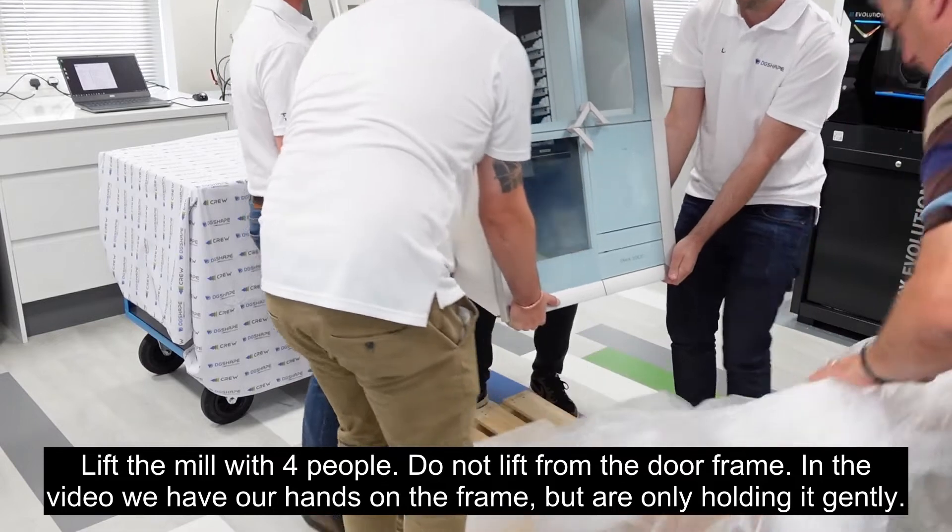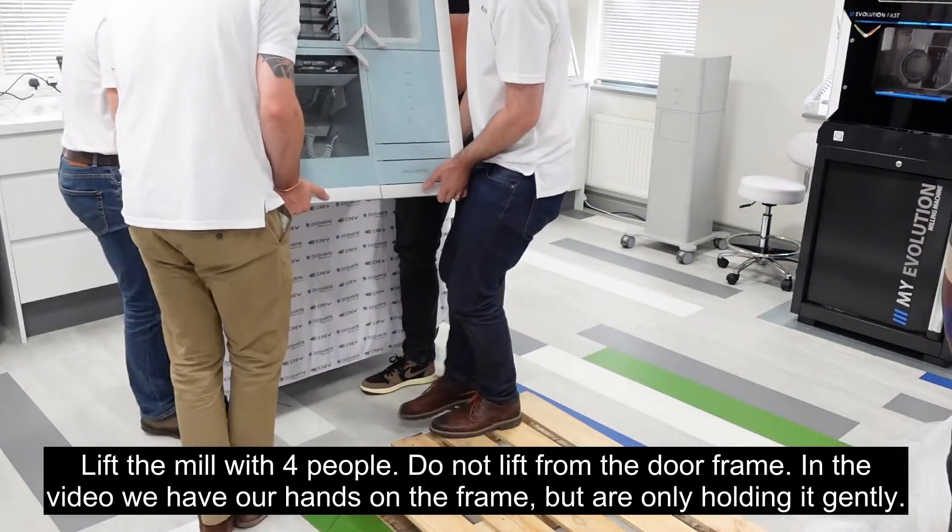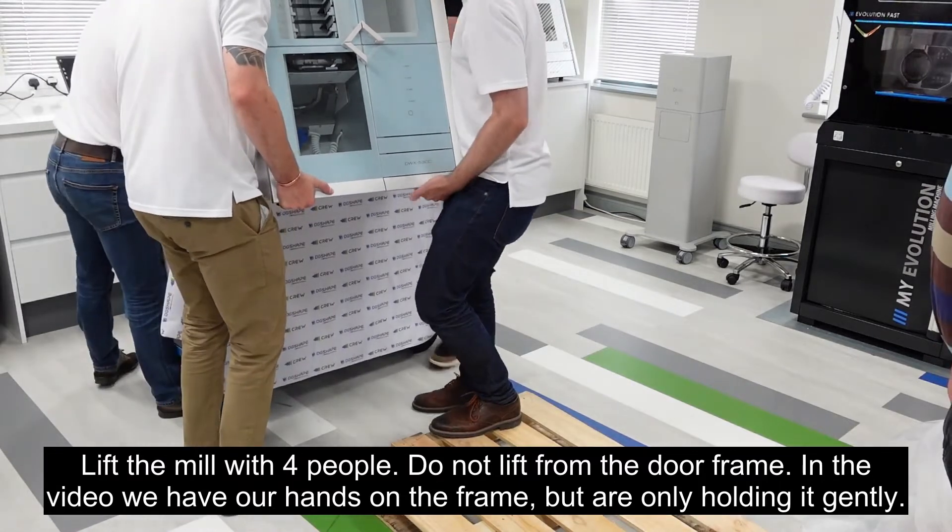Lift the mill with four people. Do not lift from the door frame. In the video we have our hands on the door frame but are only holding it gently.